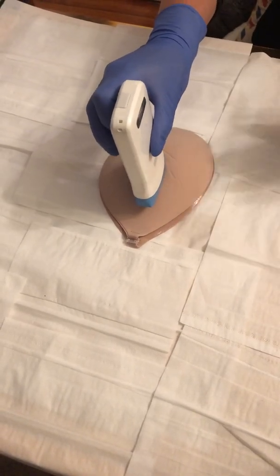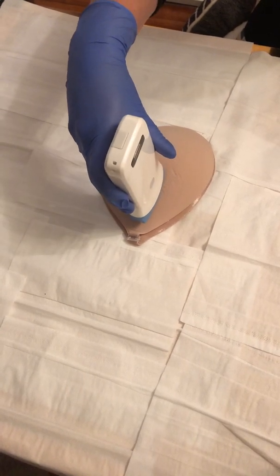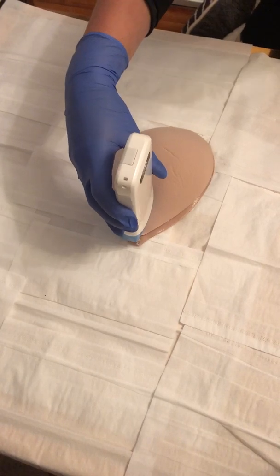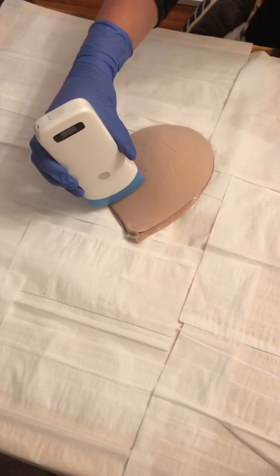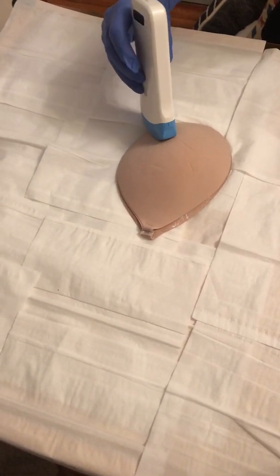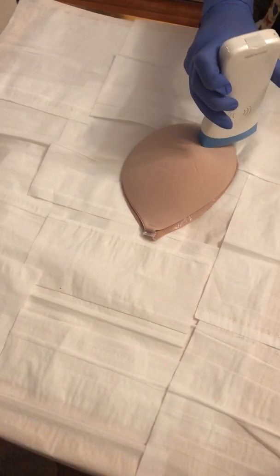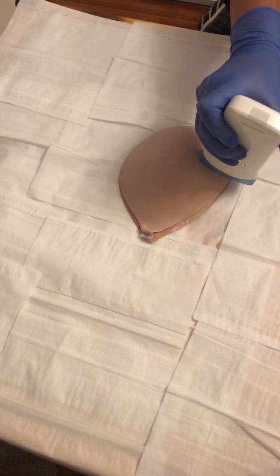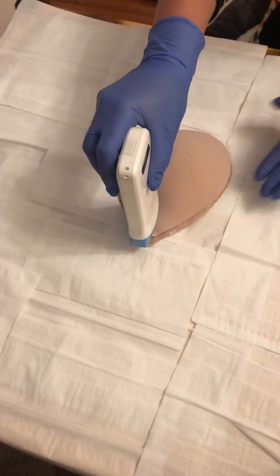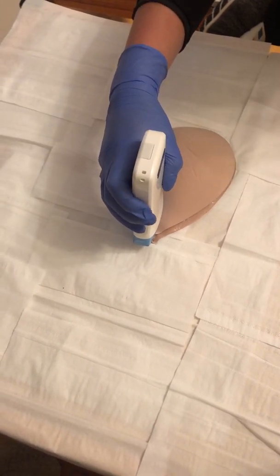We would then again repeat that scan so that we have two of each, moving laterally but still facing the nipple. We would then do our last plane and moving again in a clockwise fashion all the way around, with some slightly coming out of the breast tissue there to make sure that again no lesions or anomalies are missed, back up to 12 o'clock. And again, repeat that. So that is the radial scan.